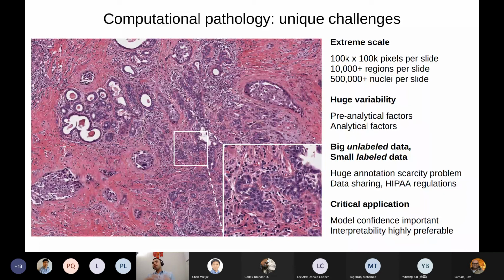So in the field of pathology, you have a pathologist, a medical doctor who is trained to look at these slides of mostly cancer, most often, under the microscope and try to determine what is the grade of the tumor, basically how ugly do the nuclei look, how infiltrative they are, what is the likelihood that this patient will survive, what are the survival prospects of people with this kind of microscopic picture, and so on.